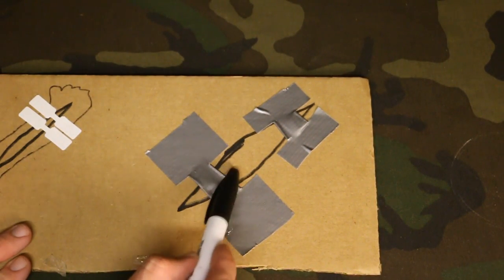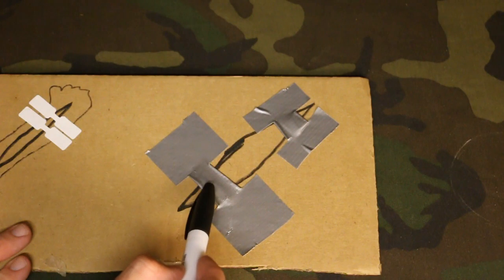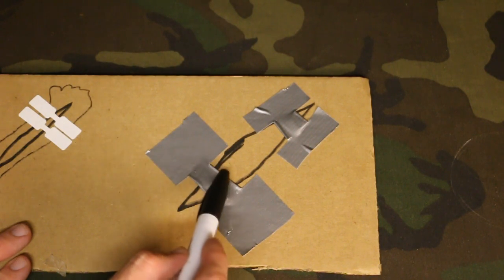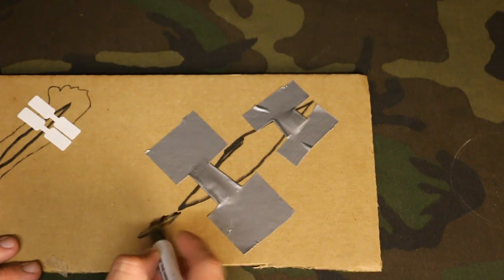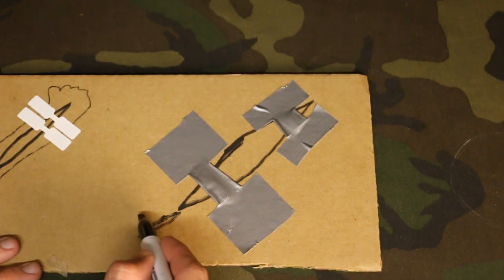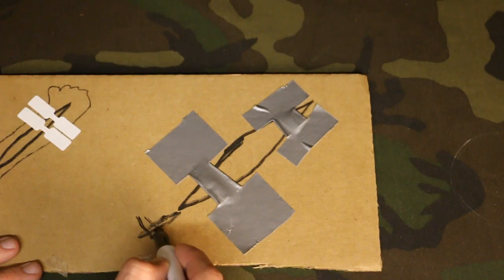Obviously here you can make this center section as narrow as you need it to be to start closing up the wound. You don't need it to be really long, obviously, if you just had a minor cut. So if this gash is only this wide here, we wouldn't really need a super huge middle section. Just a little small middle section here would cover it.